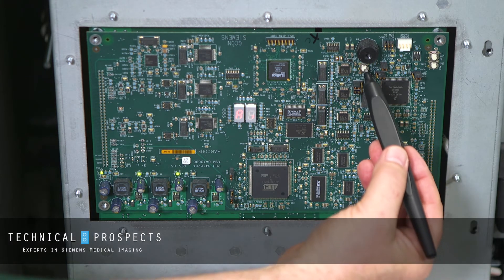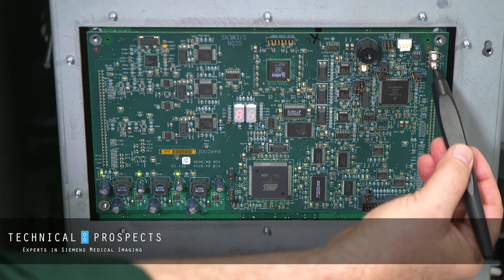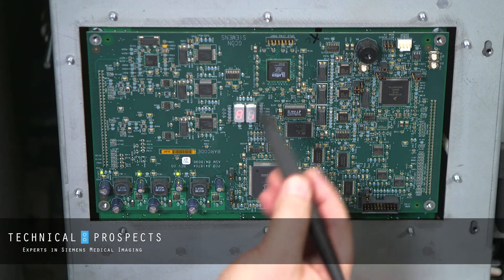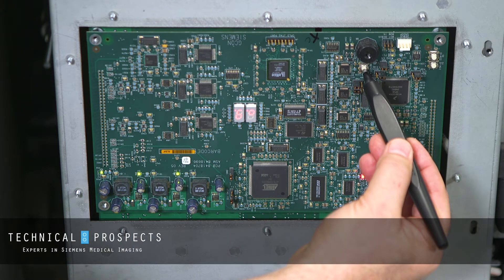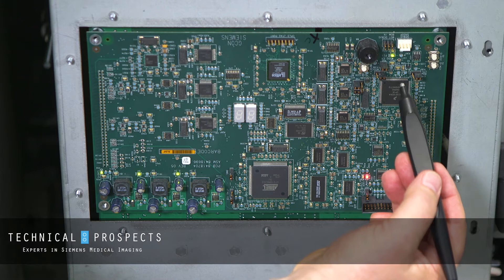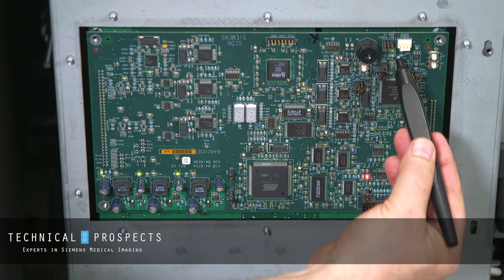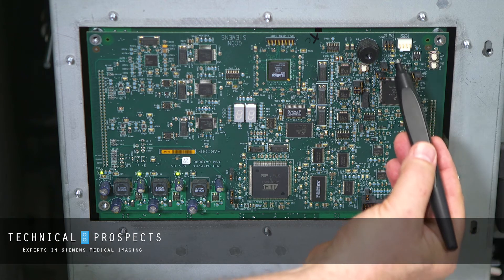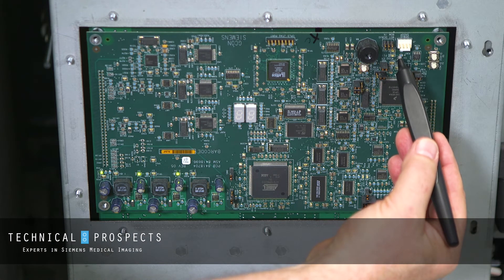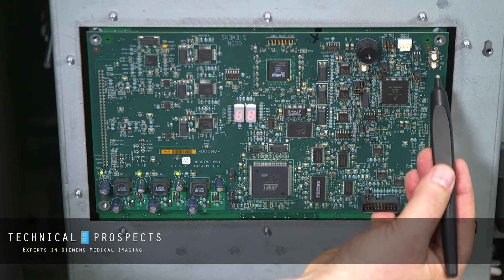We have a reset switch here, and we have an S2 and an S1 switch. When going into manual mode, we'll be pressing the reset and it'll start the sequence. We're going to be watching for a red LED to flash, and once we press the top button it'll go into two LEDs lit — a red and a green flashing simultaneously — and then we'll press the S1.